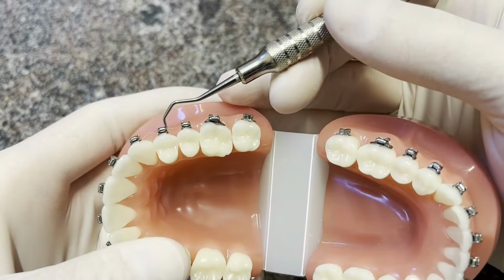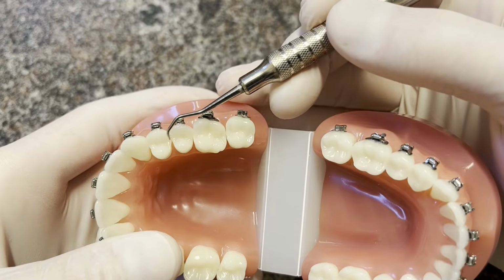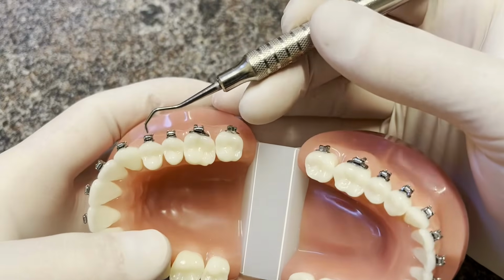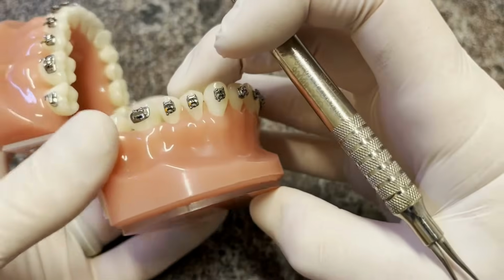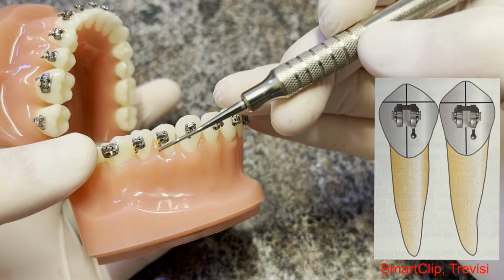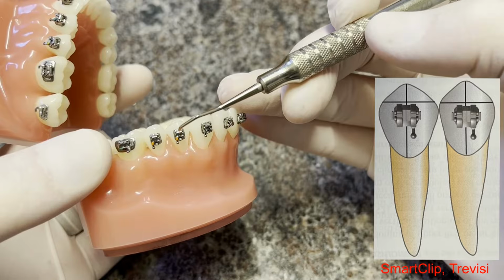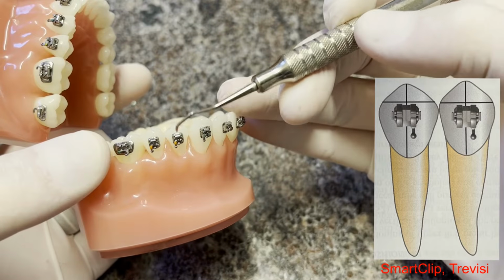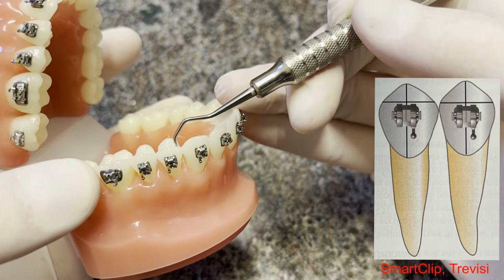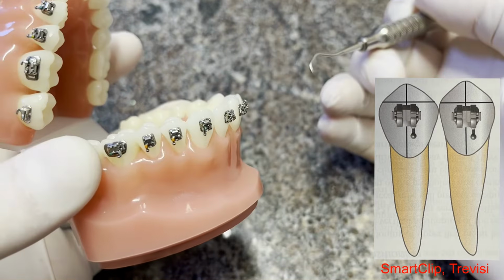The idea is you want the slot of this bracket to be parallel with a line that is running across the occlusal table right here, so that all of these teeth end up being in a nice continuous arc. So then rotationally, you want it centering that height of contour. Then you look at it from the facial surface, and you want an imaginary line running down that height of contour on the permanent tooth to be parallel to the bracket, or the slot to be perfectly perpendicular. So the way that I visualize this is I imagine a line across the mesial and distal marginal ridges, and then I set this slot parallel to that imaginary line.